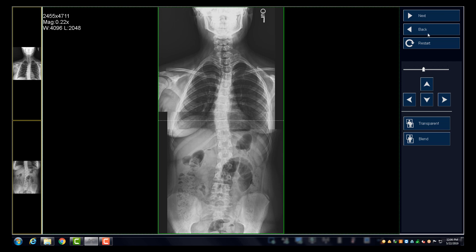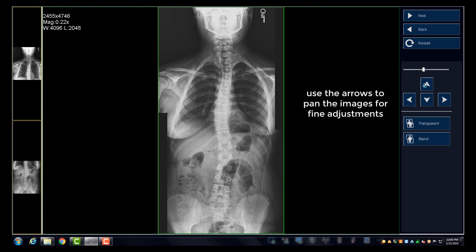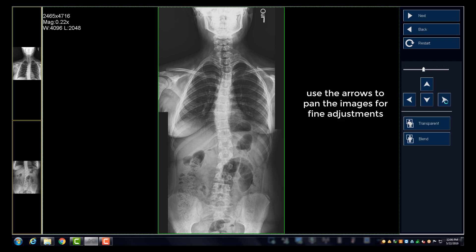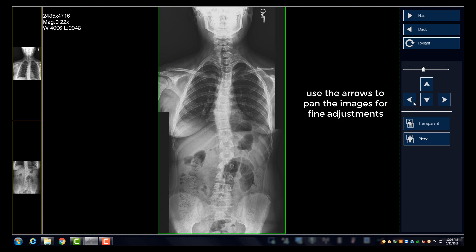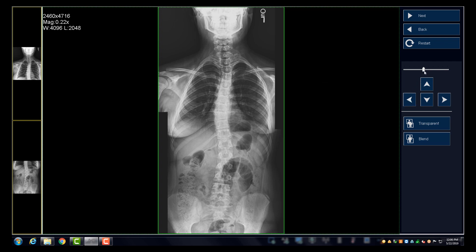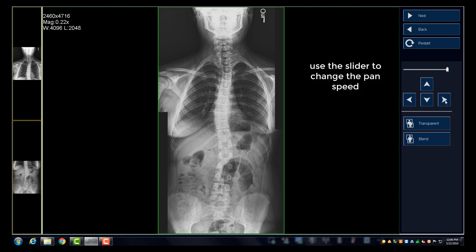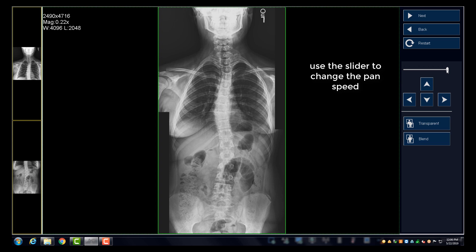Each stitching method allows you to blend the overlap area of the image, making it appear like one exposure. You can also use the arrow keys to make minor adjustments vertically or horizontally with the images. The slider above the arrow keys allows you to control the speed of the movement with the arrow keys.